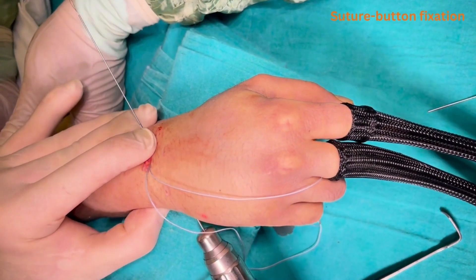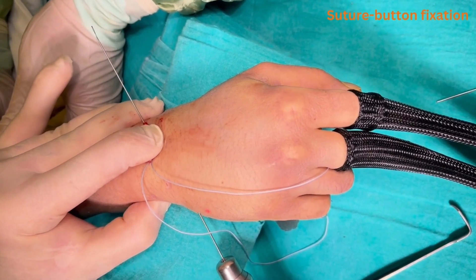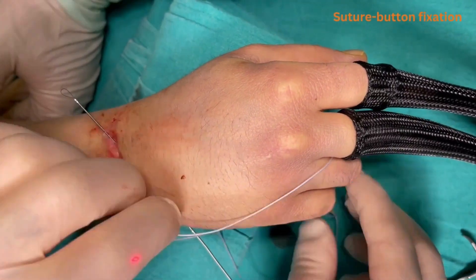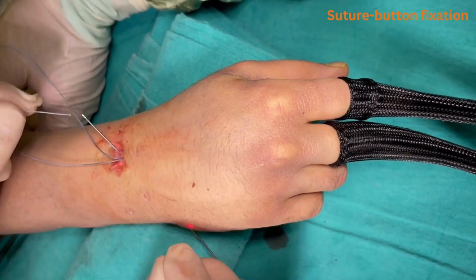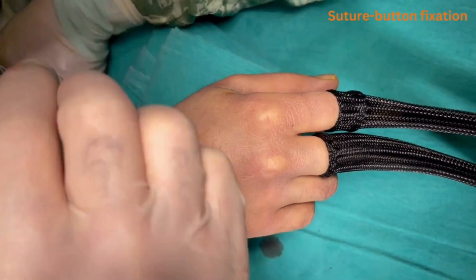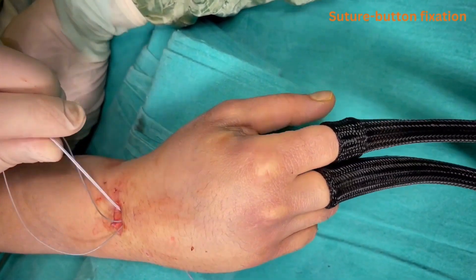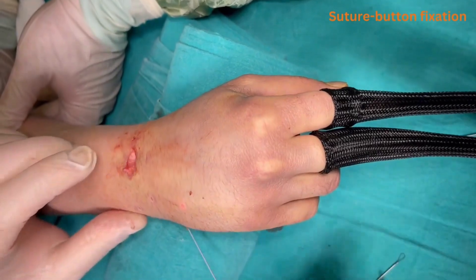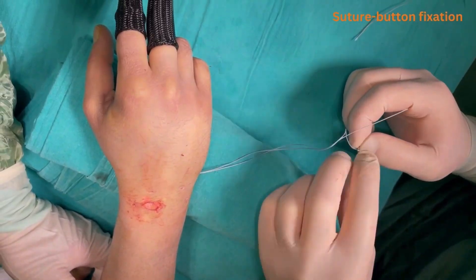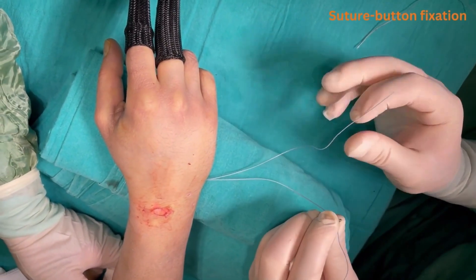The guide wire is pulled back slightly from the exit side. The suture button device is again passed through the nitinol loop of the K-wire and the opposite end of the guide wire is pulled, bringing the SB device completely through and exiting at the volar side of the triquetrum. The second button is then anchored on the triquetrum.